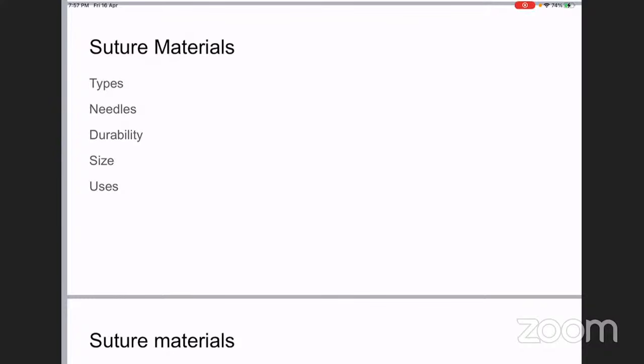Okay. So, like I was telling you, absorbable suture materials will get absorbed either by hydrolysis or by enzymatic degradation. Which are the other absorbable suture materials? There is one more known as Monocryl. Monocryl is again a trade name. Polyglecaprone is a monofilament absorbable synthetic suture material. So Monocryl, polyglactin, and catgut, and even chromic catgut.